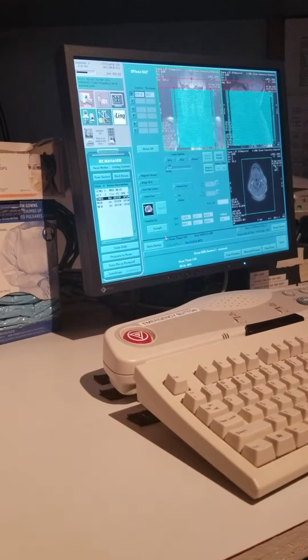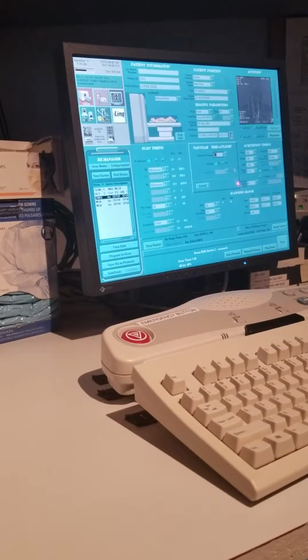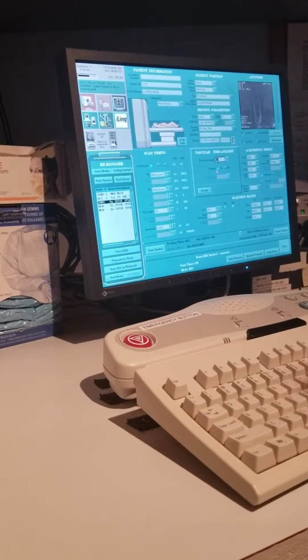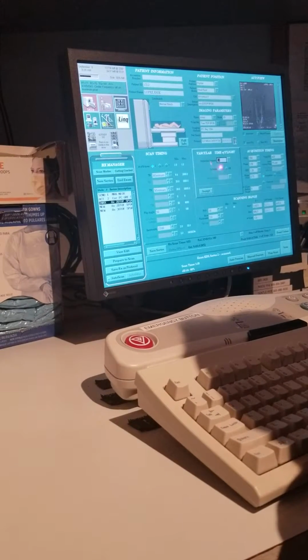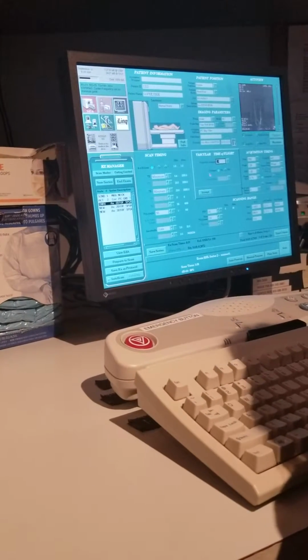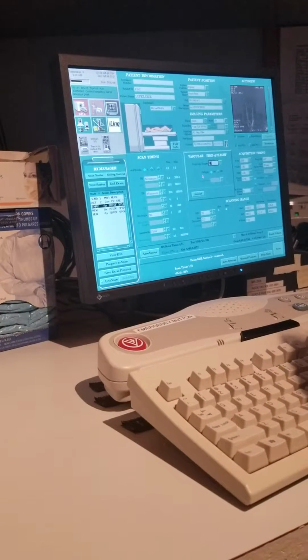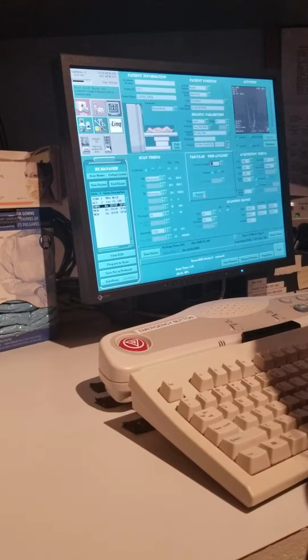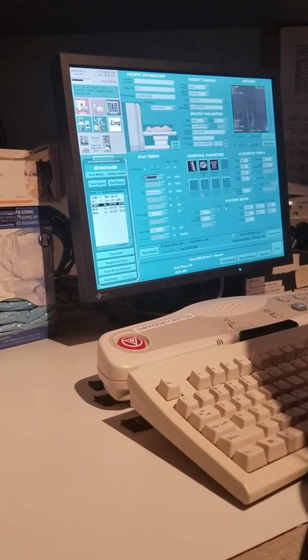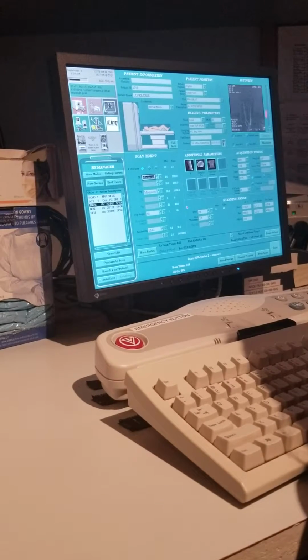Good. Now accept and go to your vascular screen. Just make sure the collapsed image is on. The collapsed image is what we need to put it all together to do our MIPing. You see how it says projection images? You're getting 19. It's going to create a series, 19 images for you in a new series, but we won't use those. We'll actually create our own series of rotation and tumble and rotate.